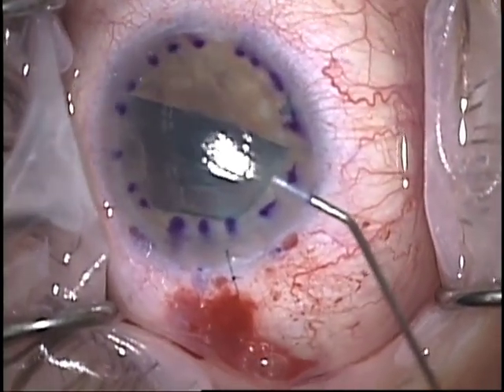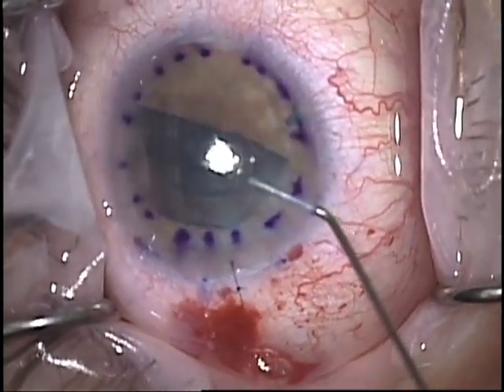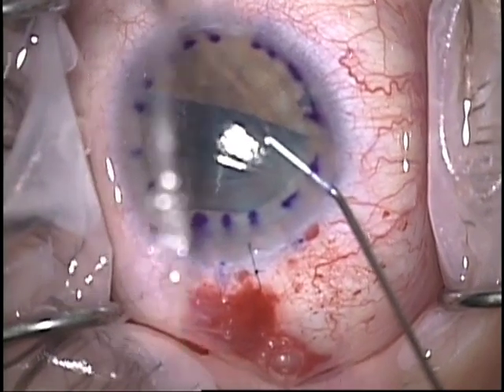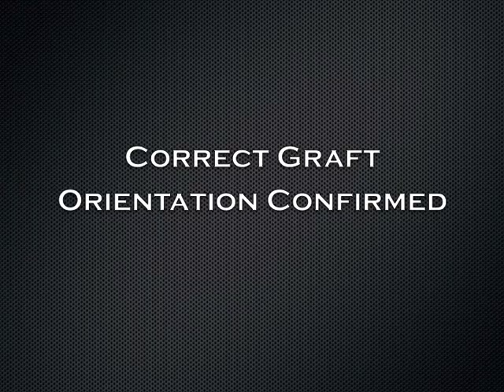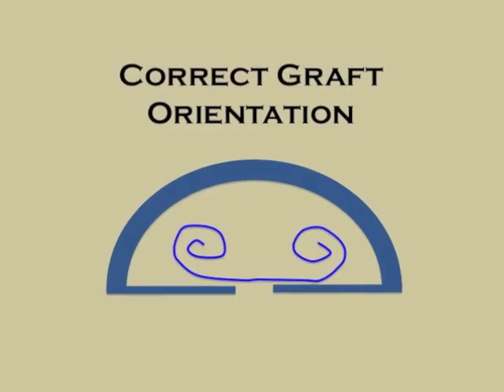Here's another clinical example. One of the drawbacks of this technique is that it does potentially damage endothelium with manipulating the graft, but it can confirm correct graft orientation, which is vitally important.